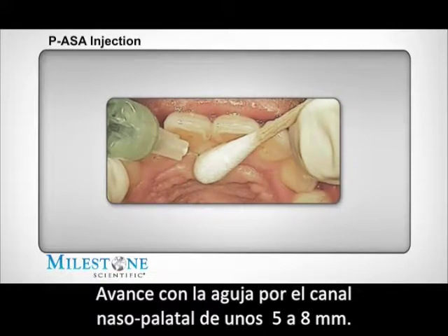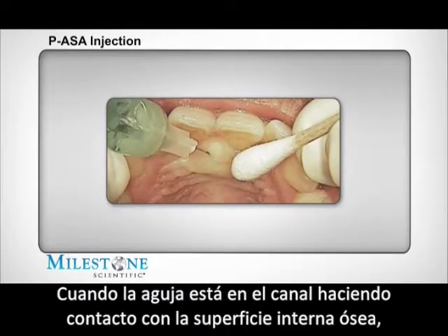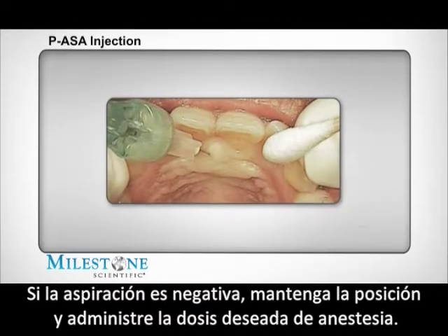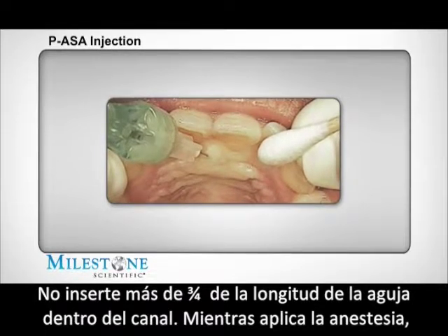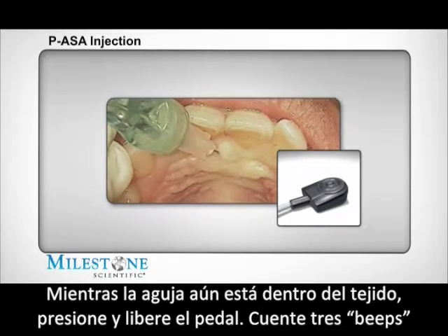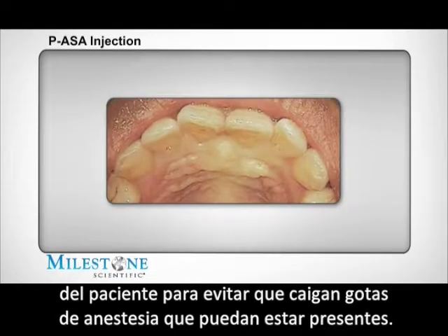Advance the needle within the incisive canal 5-8 mm. All movements must be performed very slowly and gently. Do not move the needle more than 1-2 mm forward each time — rapid movements are contraindicated. When the needle is in the canal and contacting the inner bony wall, stop movement and aspirate by depressing and releasing the foot pedal. If aspiration is negative, maintain position and deliver the proper amount of anesthetic. Do not exceed three-quarters of the needle length penetration into the canal. As the anesthetic solution is delivered, you will notice distinct blanching of the tissue. To remove the needle, depress and release the foot control pedal, count 3 beeps, then totally remove the needle from the patient's mouth and direct it away from the patient.